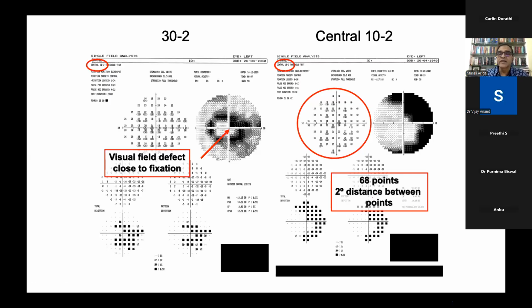Is there a split in the fixation? Is the central field involved, for prognostication and for documenting whether any change is happening when any therapeutic intervention is being planned? Do a 10-2 as well, along with the 24-2. You can also follow up with the 10-2 in the future.